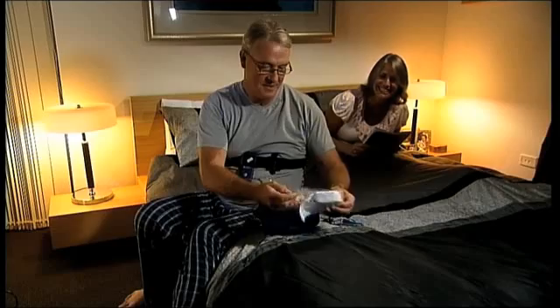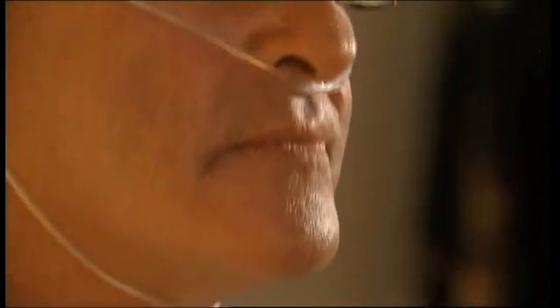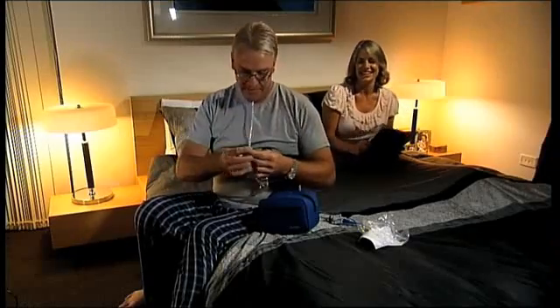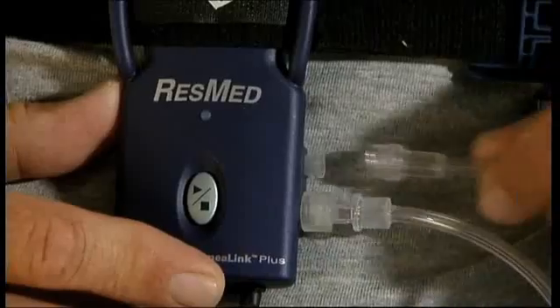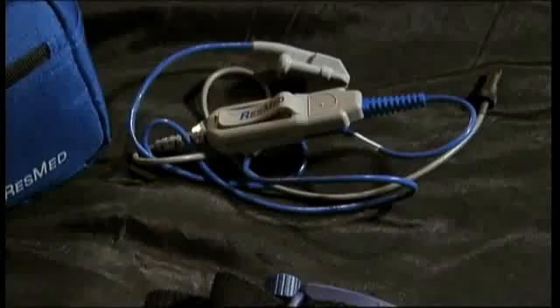Locate the nasal cannula, which measures airflow. With the two prongs facing downwards, loop the tubing over each ear and tighten the toggle under the chin. Make it snug but not so tight that it's uncomfortable. Insert the end of the nasal cannula into the recorder by turning it clockwise — your healthcare provider may have already done this for you.